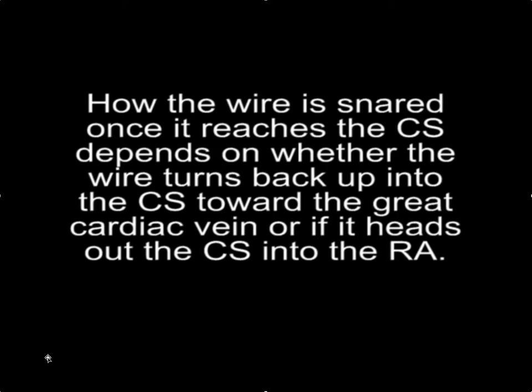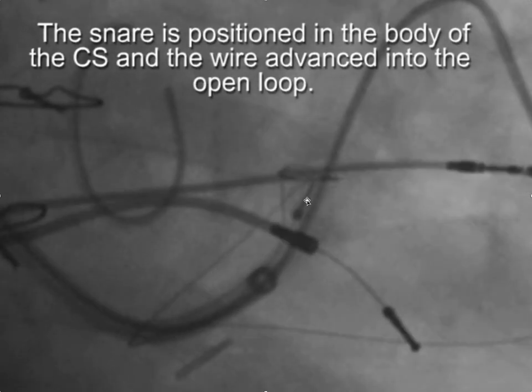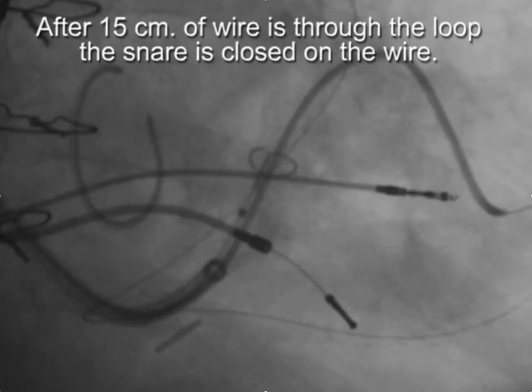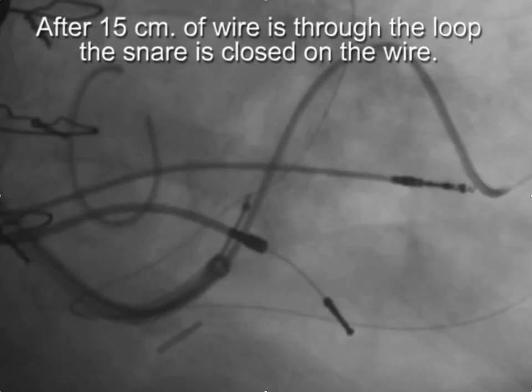How the wire is snared once it reaches the CS depends on whether the wire turns back up into the CS toward the great cardiac vein, or heads out into the right atrium. If the wire turns back into the CS, it's easier to snare because it's a captive audience within the coronary sinus. Deposit the snare in the body of the CS, withdraw the wire, and advance it into the open snare. Before closing the snare tightly, make sure you have at least 15 centimeters of wire through it to avoid pulling the tip off or bending the wire.